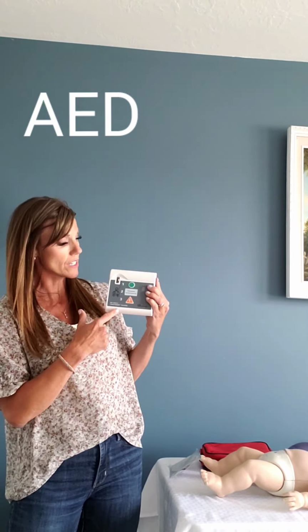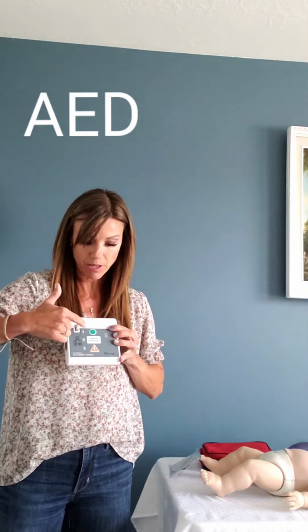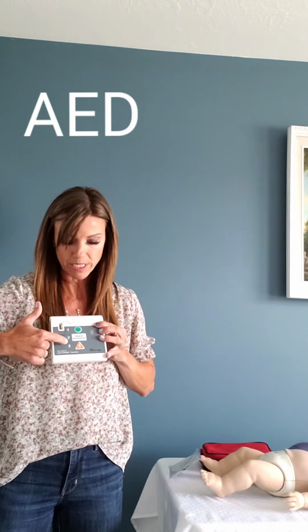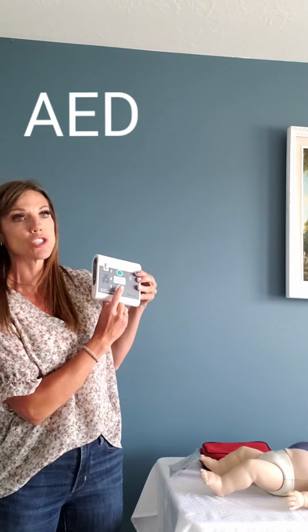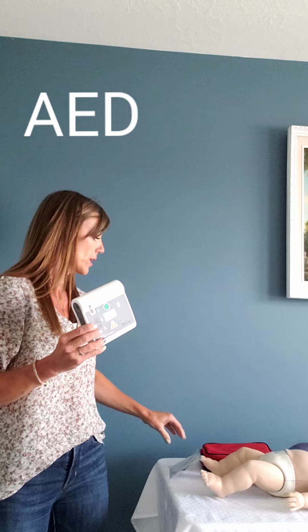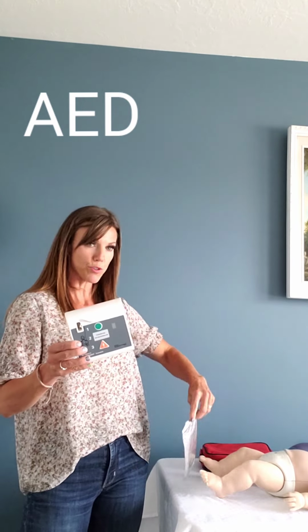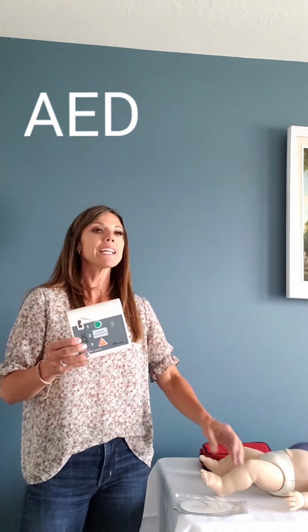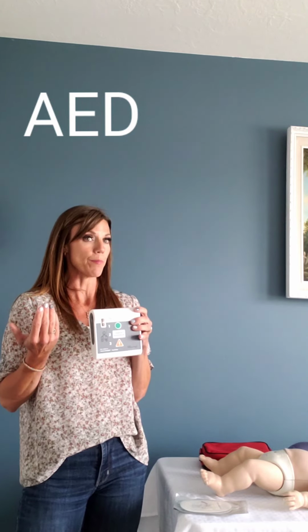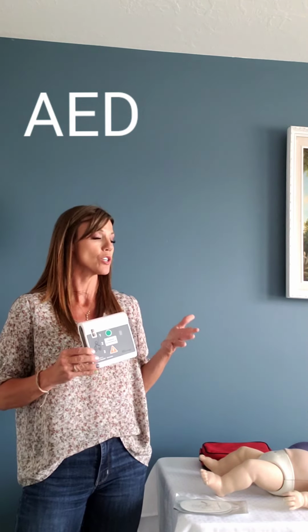Also, when you look at the defibrillator, it will have the same. It'll have number 1, turn it on. Number 2, follow the promptings. Number 3, press this shock button if the machine decides it's a shockable rhythm. So your papers you have with ventricular fibrillation, now that is the rhythm that this is going to identify as a shockable rhythm. And that's an important rhythm for you guys to know.